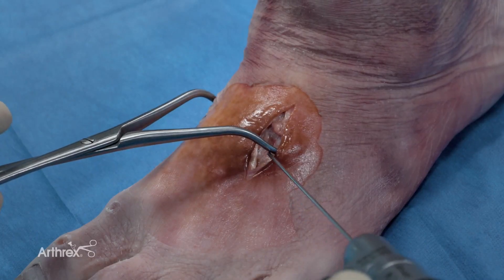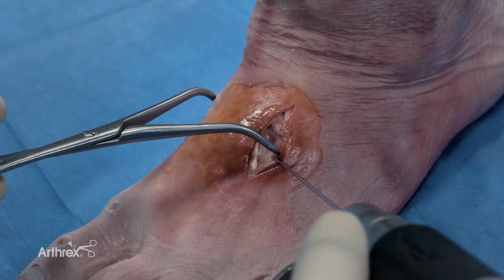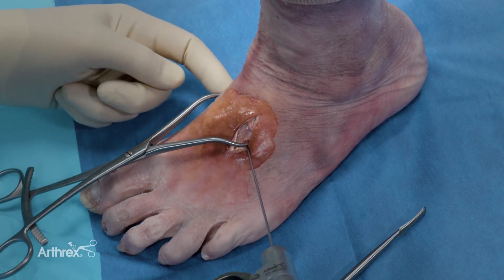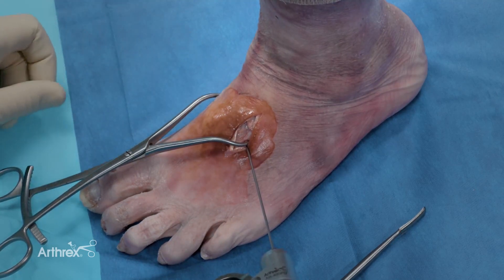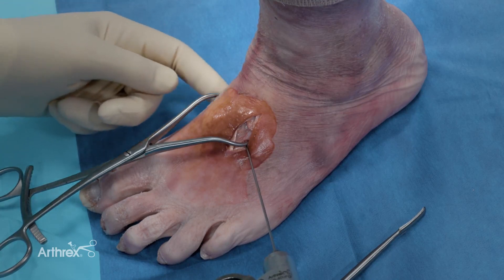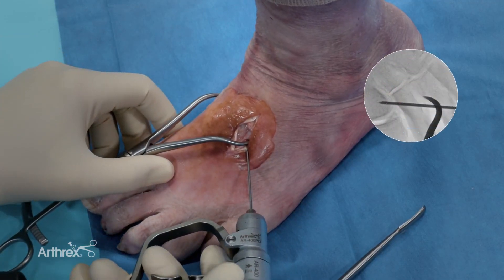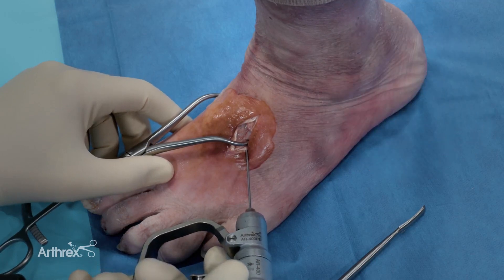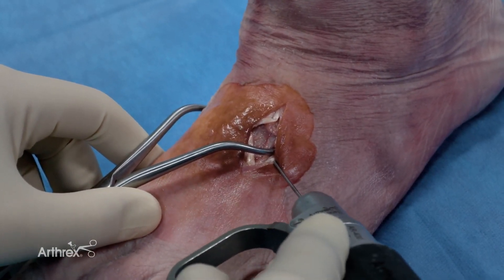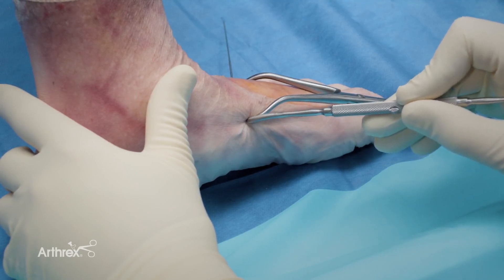Next, I place my wire. I place this usually just distal to where I place my clamp and a little bit on the dorsal aspect on the lateral side of the metatarsal base. I angle from a dorsal location on the lateral aspect of the second metatarsal to a slightly more plantar aspect on the medial cuneiform. This is more in line with where the interosseous ligament of the Lisfranc joint is located, and by coming out slightly plantar on the medial side, it helps you avoid the tibialis anterior. I want my wire to go through the central portion of the Lisfranc joint as seen on the fluoroscopic image, then pass it all the way through. On the medial side of the foot, this little bump is the wire protruding and you can see that the wire follows up just where the clamp is.